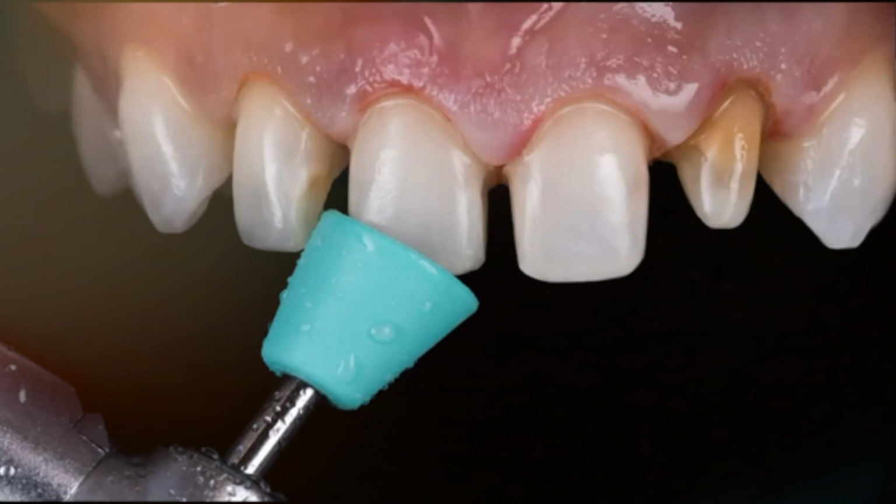So let's say we take a shade of a monolithic block, doesn't matter multi-layer or not, and we are going to mill that lateral. The final color will be a couple of things. It will be the shade you choose, factored by the thickness. So for example, if you take a B1 block and it's 0.5, it's going to be B1. If you take a B1 block and it's 1 millimeter, it's going to look like a BL. So thickness is very important. Second, it's factored by how dark the substrate is. That also impacts the color. It's factored minorly by the cement you use, which you don't really want to mess around with too much because it's not predictable.